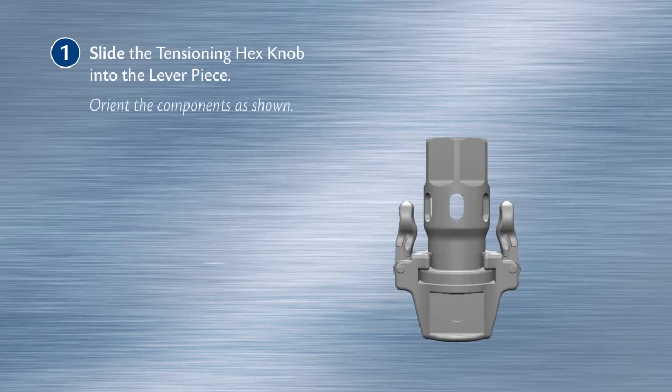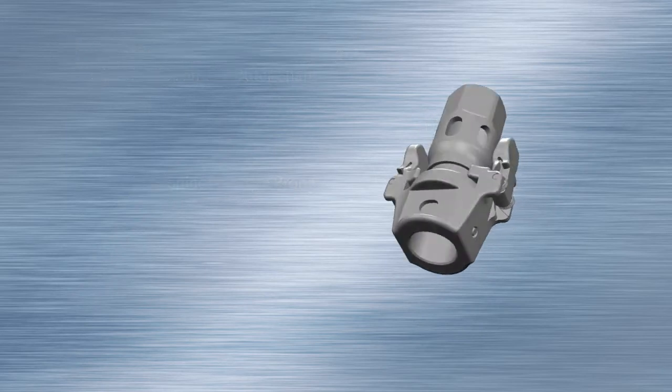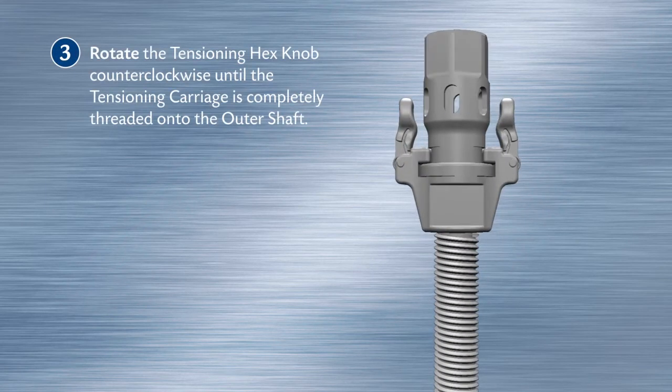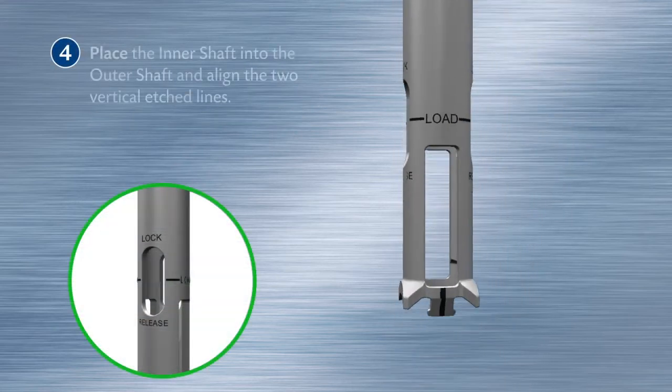Orient the components as shown. Align the tensioning carriage prong with the slot on the outer shaft. Rotate the tensioning hex knob counterclockwise until the tensioning carriage is completely threaded onto the outer shaft.